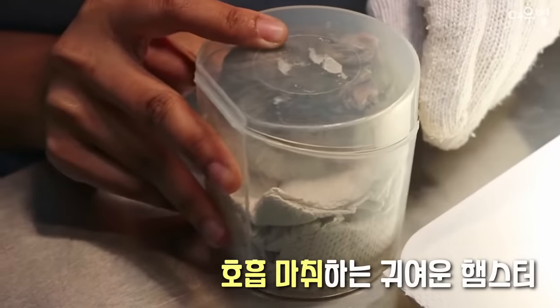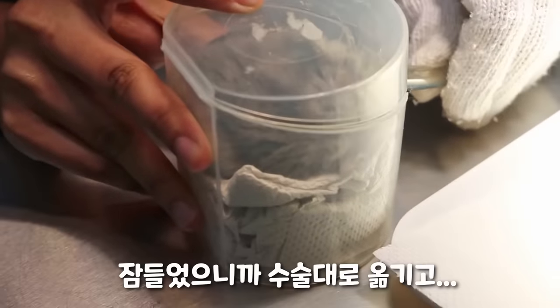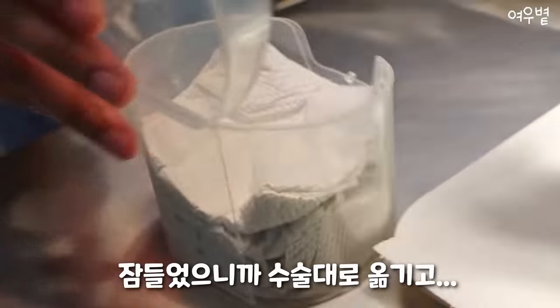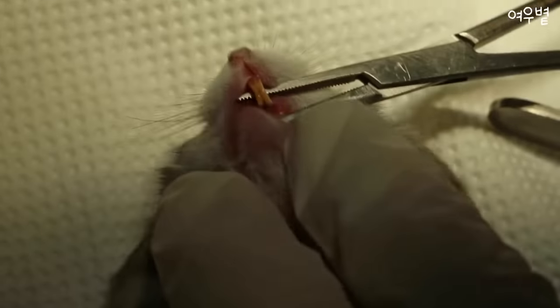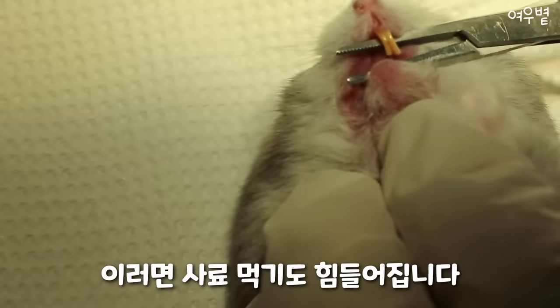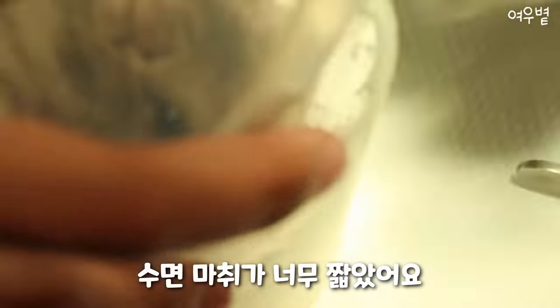Is it down? Almost down. Put it up first and put it inside here. Definitely the upper tooth is very long. Very long. I feel like there's some texture or something. We'll put it back again because this anesthetic is too short.